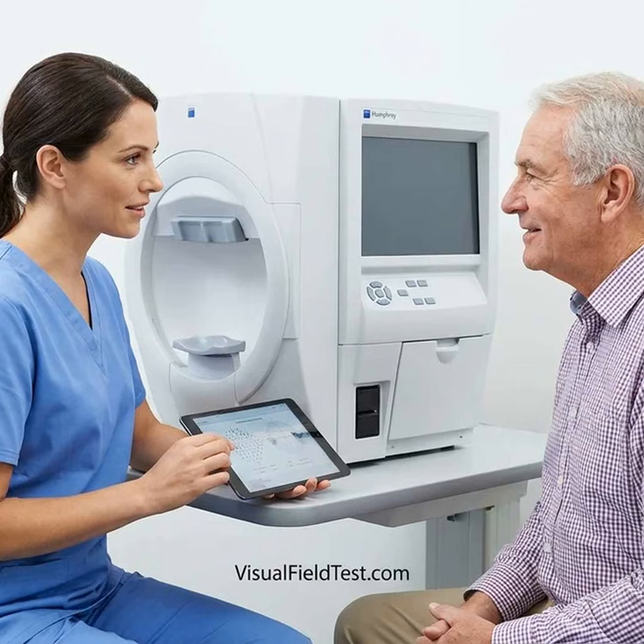Patient education to improve visual field test performance and reduce anxiety. Visual field testing, also called perimetry, is essential for detecting and monitoring glaucoma, optic nerve disease, retinal disease, and some neurological conditions. During standard automated perimetry, one eye is tested at a time while the patient looks at a central target and presses a button whenever a light is seen in the surrounding area. The test estimates how sensitive different parts of the visual field are.